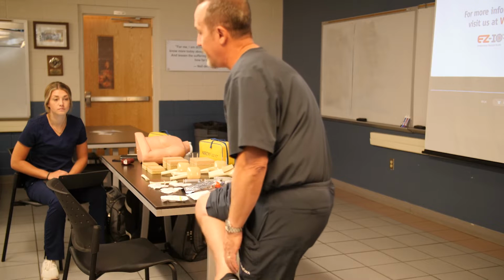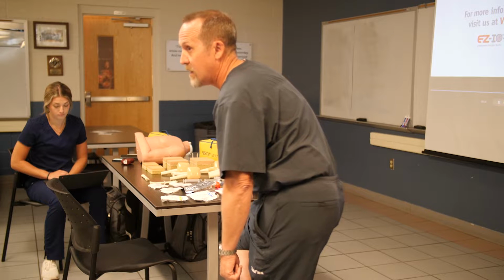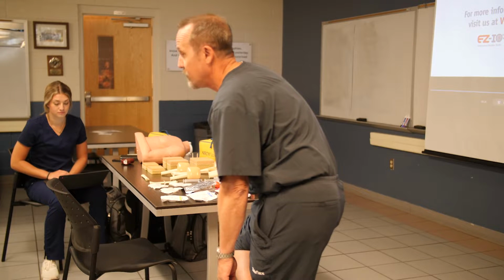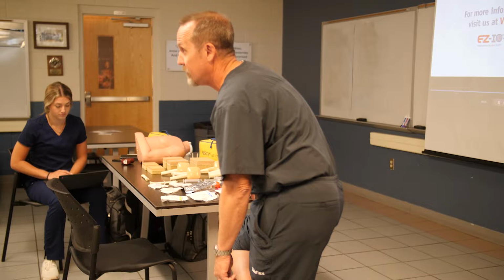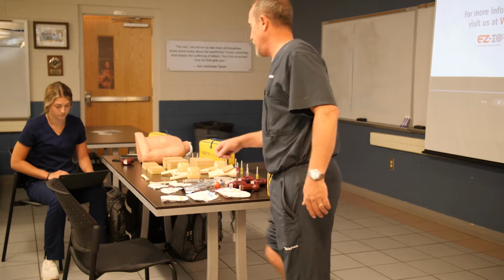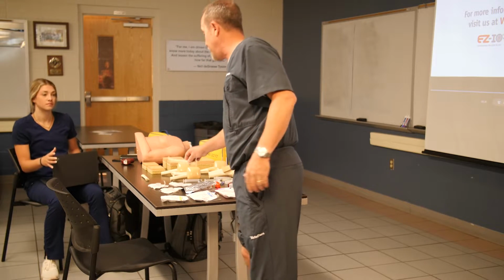Okay? On the distal, you're going to find the most prominent aspect of your medial malleolus. It's going to be that bump that you knock on a coffee table when you walk by. You're going to go about 2 centimeters proximal to that and go straight into the bone there. But remember, this is going to be the furthest from the heart, and you're getting only about 1 liter per hour. Okay? So now when we talk about on a pediatric patient, if we decide we're going to go into the femur, as I mentioned, your tibia is tiny. Trying to hit that spot is going to be really small, especially in your smaller patients.